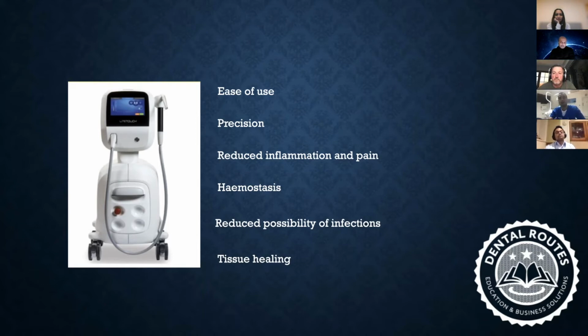Lasers are very precise in action. They're very easy to use. There is very minimal skill required. There is more knowledge required, but skill levels are a very minimal requirement. The lasers can be used in contact with tissues as when you are treating soft tissue, and out of contact when you're treating hard tissue like teeth or bone. So unlike conventional techniques using rotary burrs, there is no possibility of accidents like slipping of the burr, which could cause catastrophic damage to adjacent tissues.